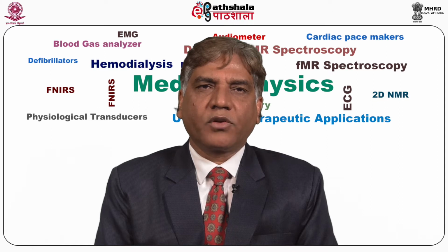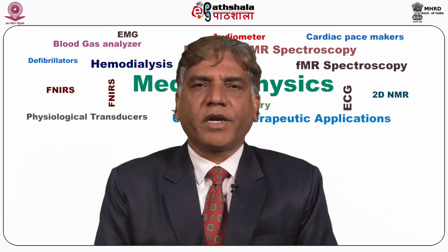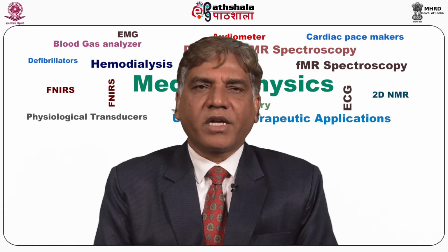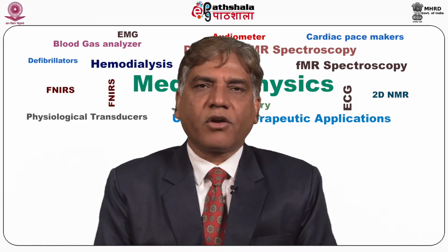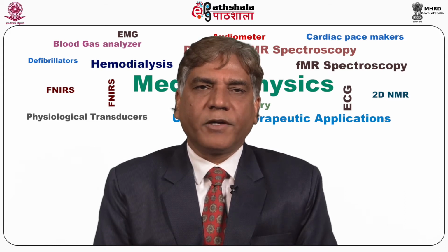MRI plays a very vital role in patient care. Some of the biggest advantages of MRI are that it provides excellent soft tissue pathology, it doesn't need any ionizing radiation, and direct imaging in any plane is possible. The basic principle of MRI is based on nuclear magnetic resonance, the interaction of hydrogen nuclei in our body that provides the images based on the Zeeman level of nuclear spin.